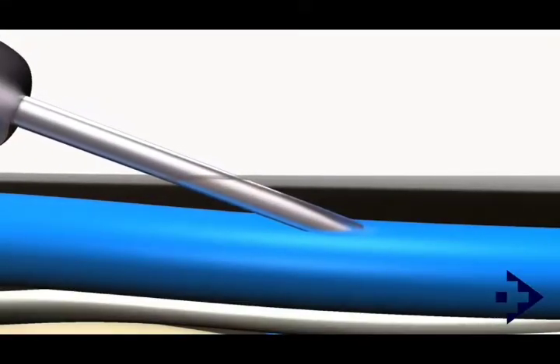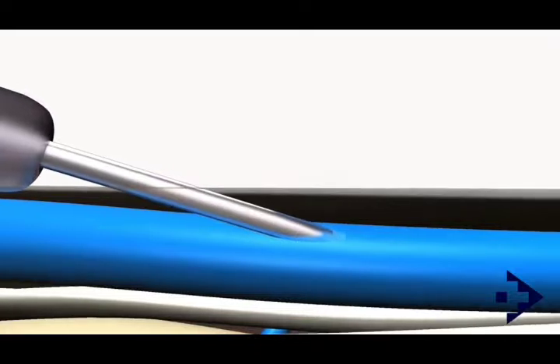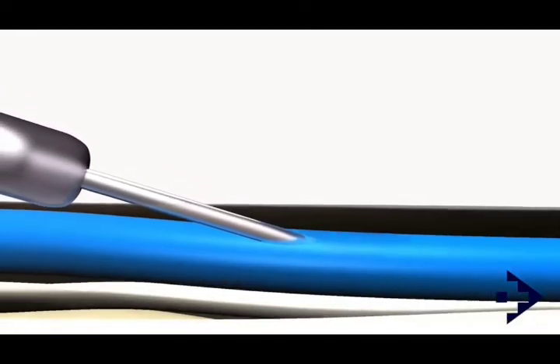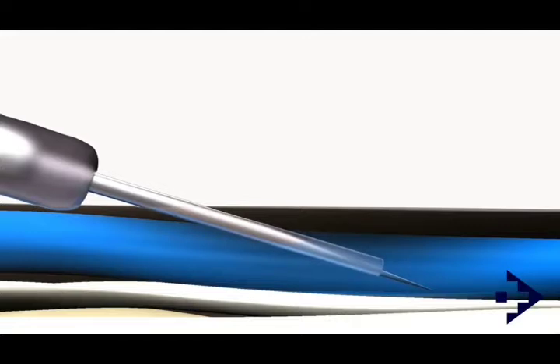At this point, we slightly lower our hand to reduce the angle of the cannula. The needle is then gently progressed a further 2 to 3 mm.